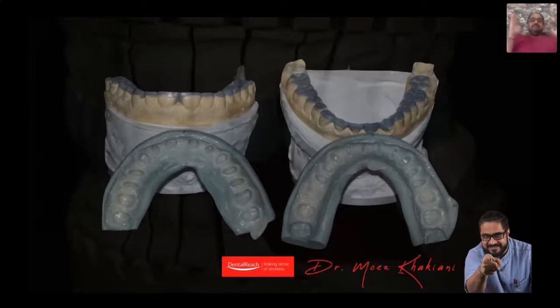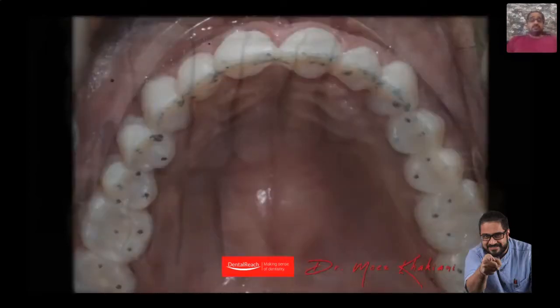If I have teeth that have parallel preparations, I will be able to keep all my temporaries in one piece. That's how it looks. I've taken a 40 micron articulating paper and put it into the patient's mouth, horseshoe shape. I've reclined the chair. Now this is important, friends. Reclining the chair is key to centric relation, because as I recline the chair, the mandible is pulled back because of gravity. Never should you check CR in a seated position.